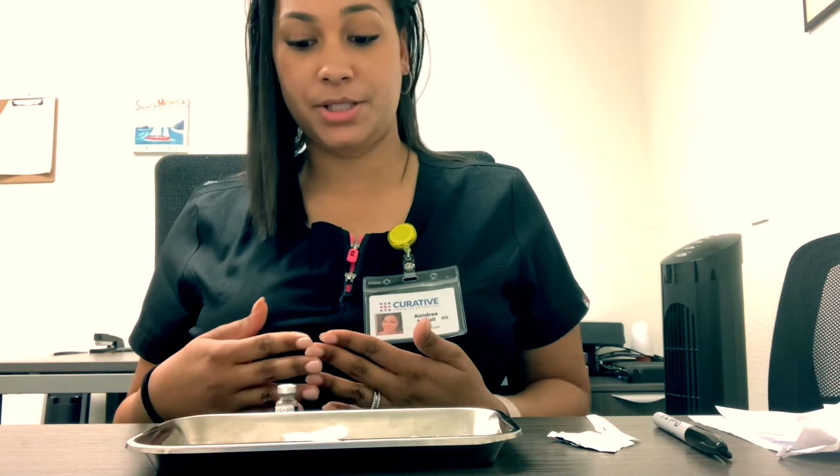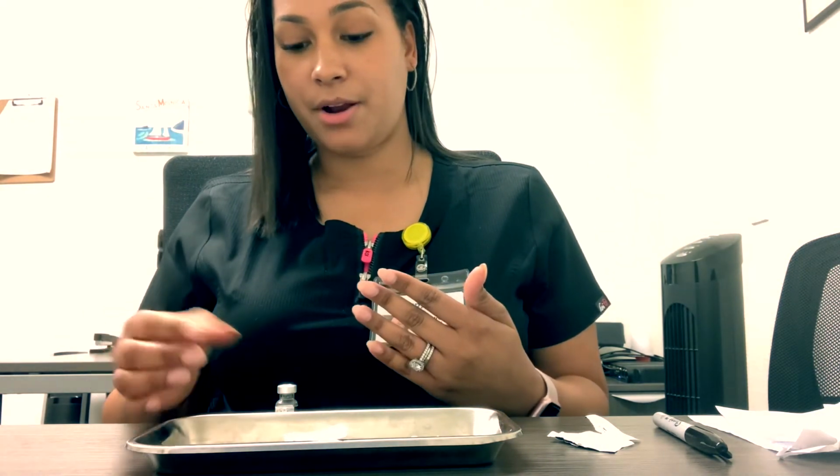Prepping your dose. So before you prep your dose, of course, we're going to check our expiration date. We're going to make sure that our vaccine is within the date and we are okay to use it. After we check our expiration date, we're going to go ahead and inspect our vial, making sure that it is clear to slightly yellow and there are no particulates floating in it. For J&J, you have to swirl this vial for a true 10 seconds between each dose. You have 5 doses in here, so you would have to swirl this vial 5 times. So make sure it is the true 10 seconds, so you can use Mississippis, like 1 Mississippi, 2 Mississippi, 3 Mississippi, until you've reached 10.